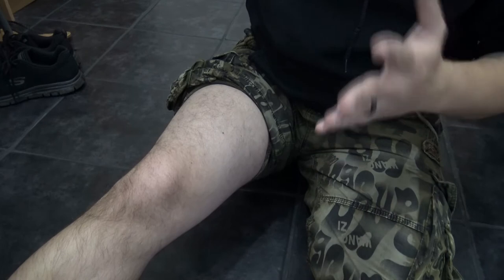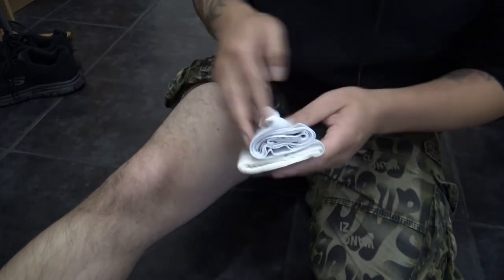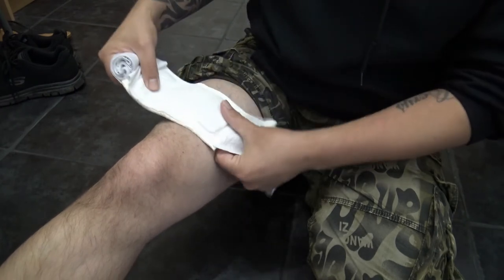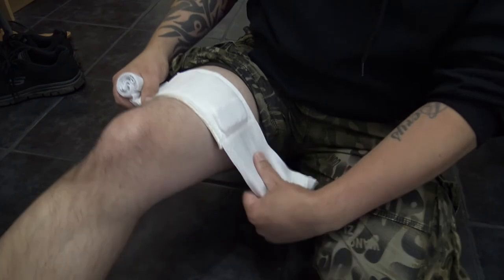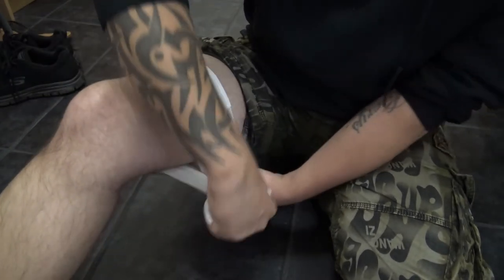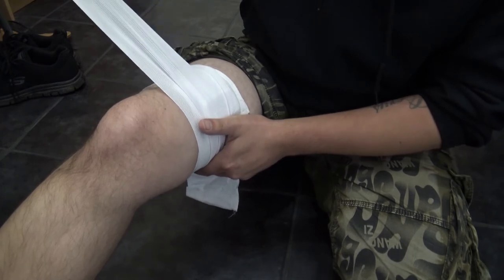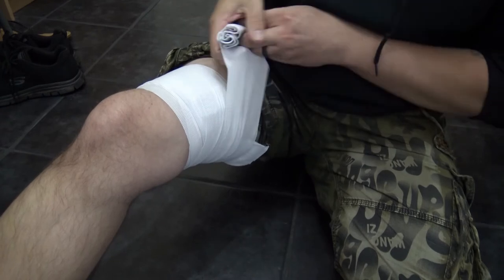Here is my very pale looking leg — the sun doesn't normally get this high up. So you're going to take the dressing, locate the pressure pillow and place that over the actual wound itself. Hold it on, use your other hand and pull nice and tight. With this elasticated bandage you're going to wrap around over the pressure pillow and go round and round — stretch it out and then wrap — going above the wound site, below the wound site and over the wound site.